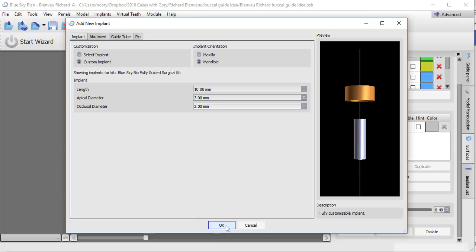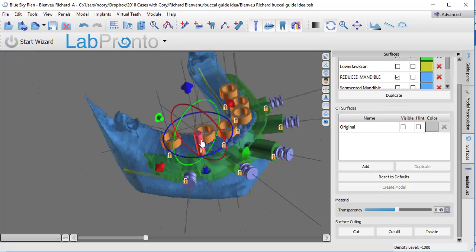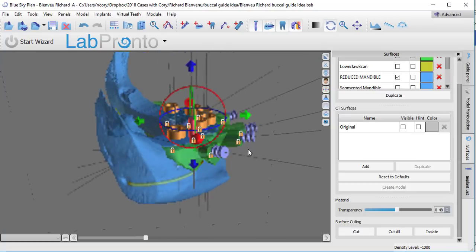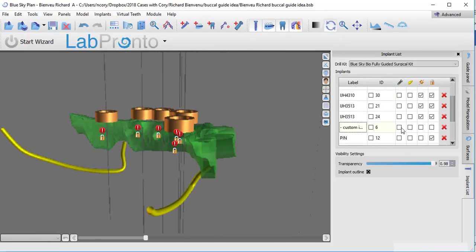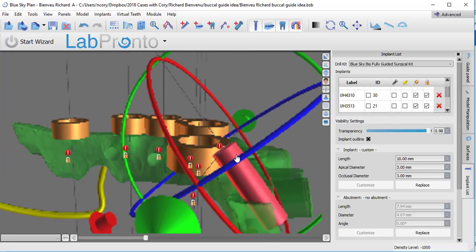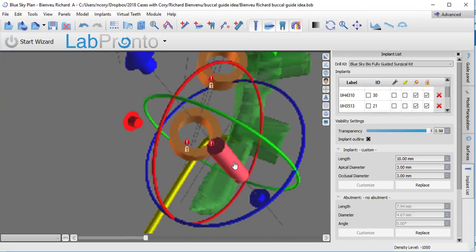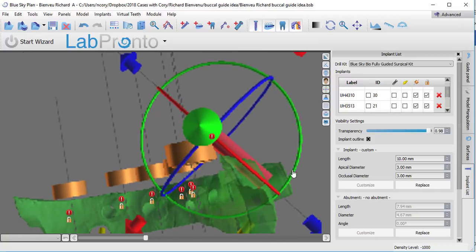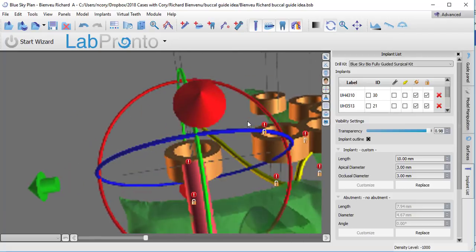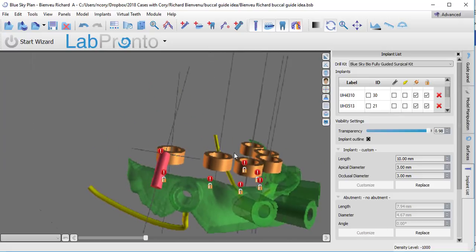Okay, so now I'm going to click all right, and I'll just drop this into the case. And what I can now do is start connecting the guide tubes down to the surgical guide. So I'm going to drag this over until it just connects to this guide tube. Pull it down vertically. And then the other end of it just needs to be long enough that it connects in with the printed resin. Because what we'll do is we'll export all of this together.